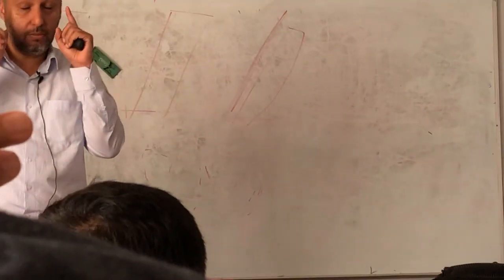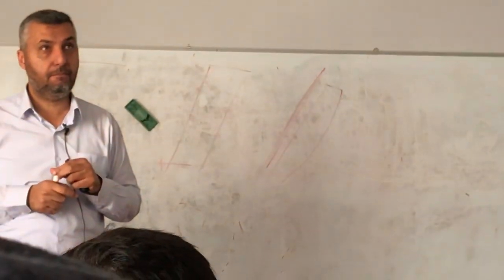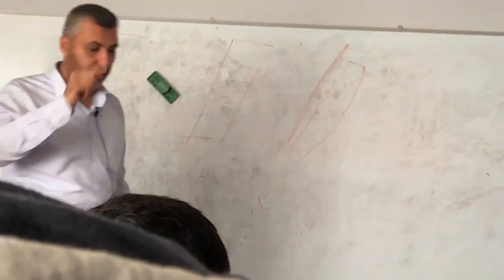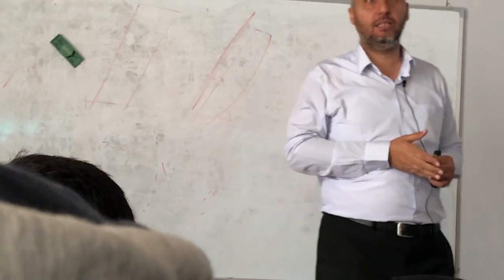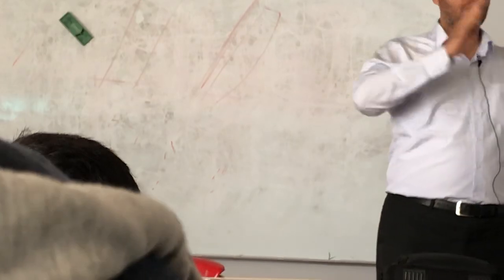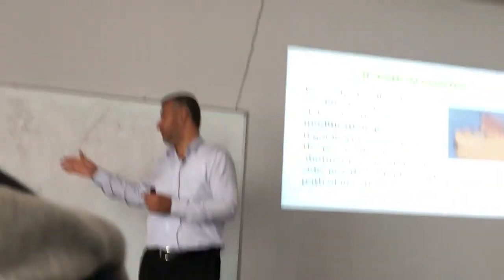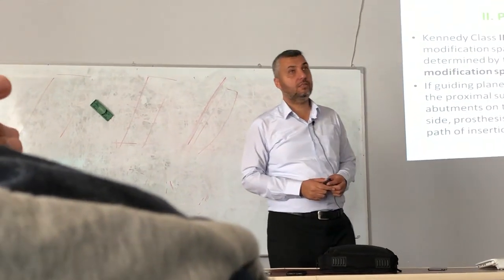Be careful, sometimes it is very difficult to make all multiple surfaces parallel. It's difficult to make all surfaces 100% parallel. So as much as the surfaces increase, the paths of insertion will decrease. As much as the surfaces decrease, the paths of insertion increase. Clear?